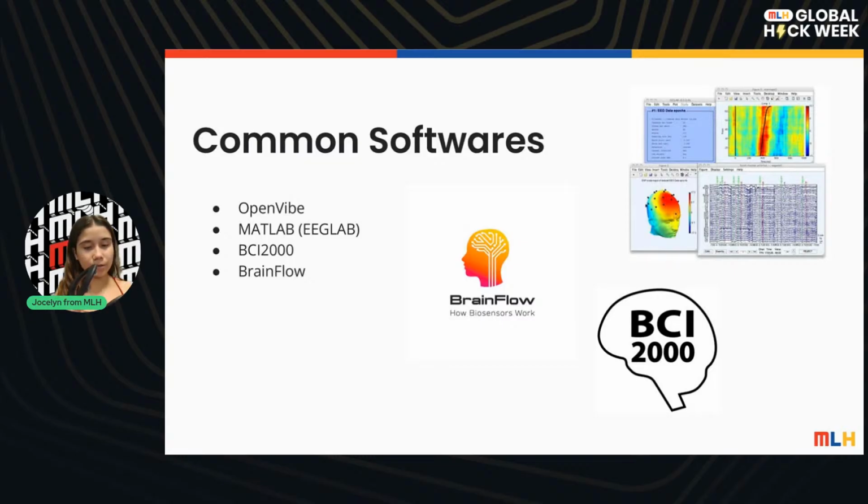To be honest, when I started using this one at first, I thought it was really cool because you can have all of the motor imagery and get it working. But once I started using it, honestly, there were some challenges, because I could only train one signal, and when I tried training two signals, it just couldn't tell the difference between them, which was pretty lame. And when I was using the Unicorn Hybrid Black, I got it working at my first attempt. So yes, it was really stressful to make all the recordings and start recording basically everything.